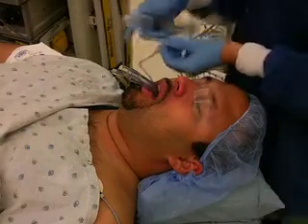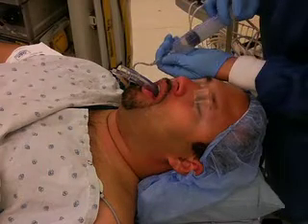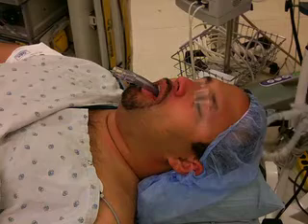Inflate the cuff with approximately 30 milliliters of air. During inflation, the shaft of the airway often moves out of the mouth 1 to 2 centimeters as it finds its proper location. The cuff should not be visible when the tube is in the proper position.